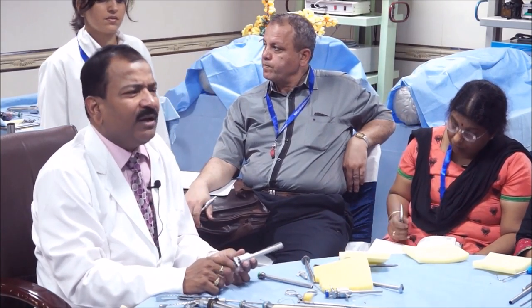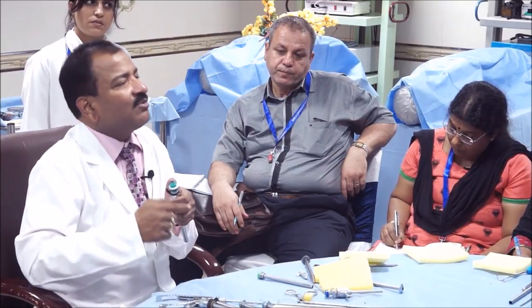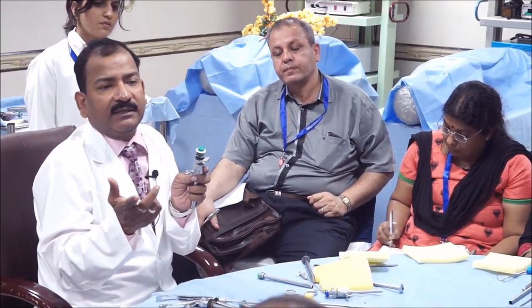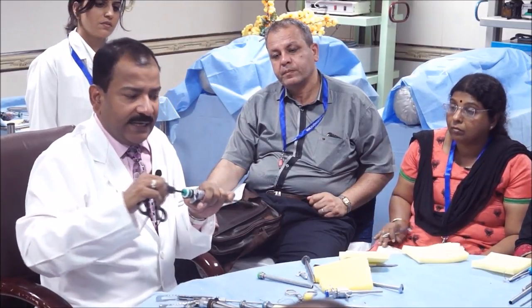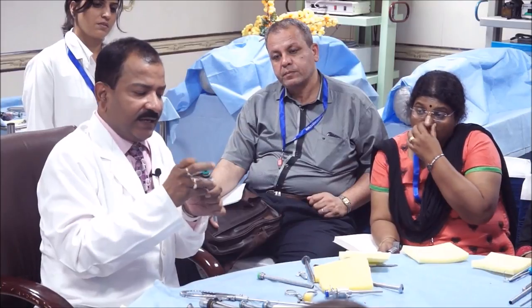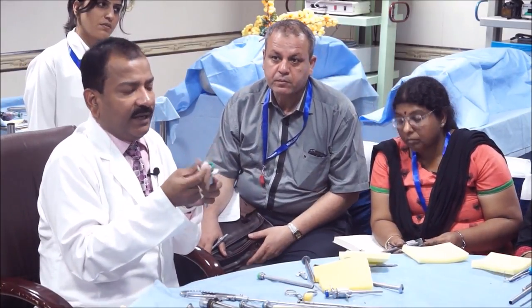But if you have to use it only for instrumentation, then use the top mounted, because the long reducer, you know, goes with the instrument and comes with the instrument. Here it is not bypassing the valve. So, in spite of being attached, gas will not leak, because the valve is still working. And then I can use the 5 mm instrument and I can take this 5 mm out, again I can use another 5 mm, isn't it? And if I have to use 10 mm, I can do like that and I can use 10 mm. And it is hanging there waiting for me. Again for 5 mm I can.